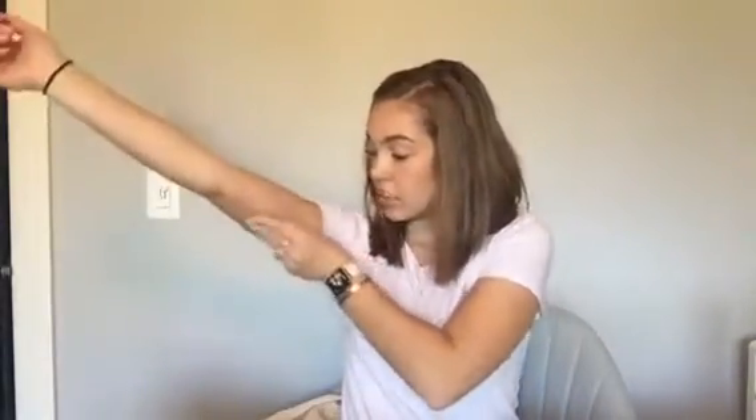I still have my G5 on, and I'm just going to wear the G6 and kind of compare and see how they go. First, I'm going to clean — I'm just going to put it on this arm, since I have the G5 on this arm. I'm just going to clean under my arm where I plan on putting it.